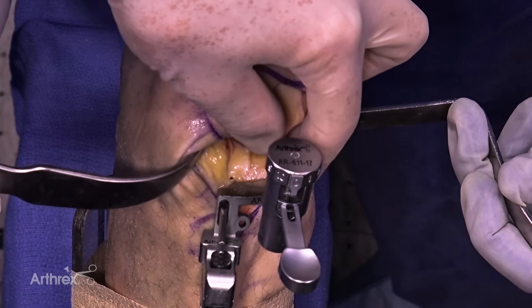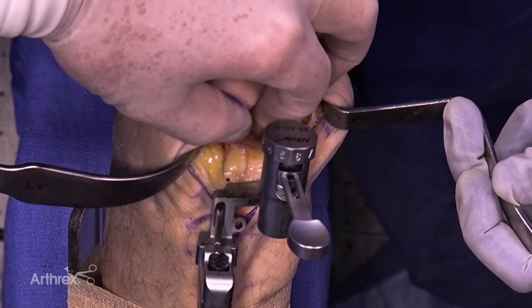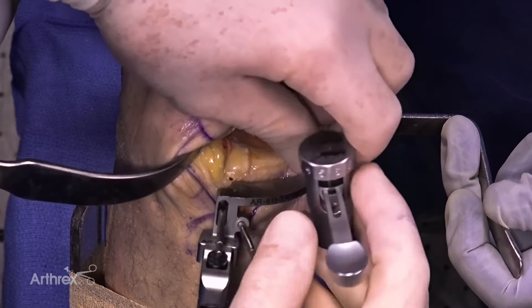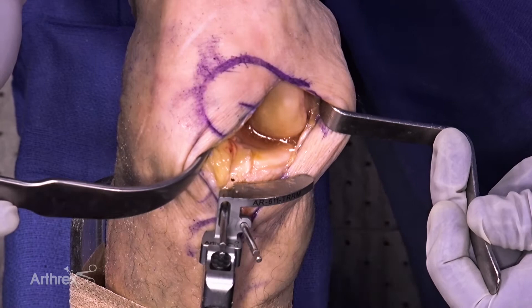Next is adjusting the height. I slip the stylus on and put it on the lowest portion of the worn surface of the tibia, then slide it onto the guide. Right now it's reading zero and I can dial it down. I usually use four as a minimal; if it's a tight knee I usually use six, so I would go with six and then pin that into place, fixing our height. Depending on the wear pattern, you don't want to take too much tibia, but in a uni the space can be really tight — you need to take at least four to six. Next, the goal is to fit an eight spacer block in.